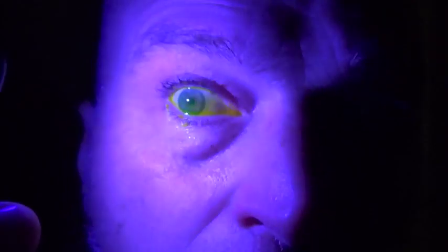Use your fluorescein strips or fluorescein eye drops and take the patient into a darkened room, and then turn on the flashlight app and you'll see clearly the fluorescein is fluorescing. The darker the room is, the better this will work.